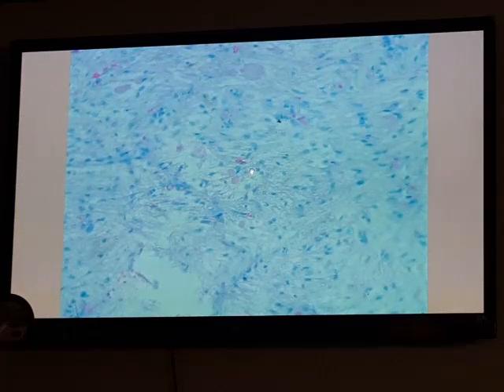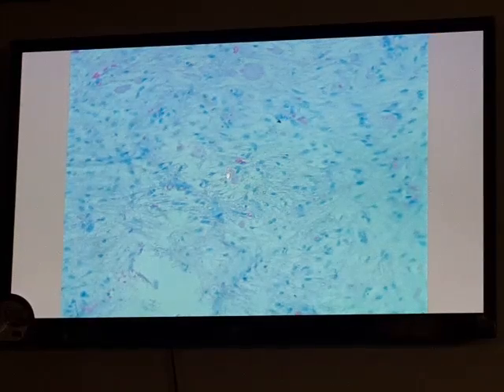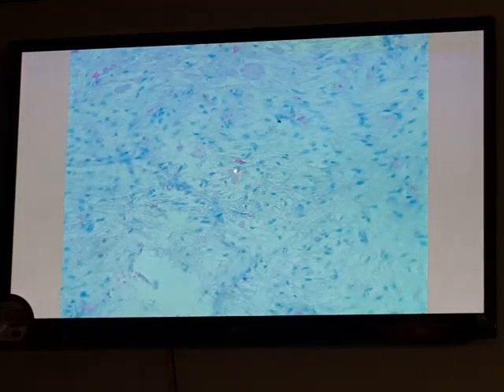The secretion reaches this area from the supraoptic and paraventricular nuclei along the axons and accumulates in dilated endings, forming structures called Herring bodies. These structures are Herring bodies.